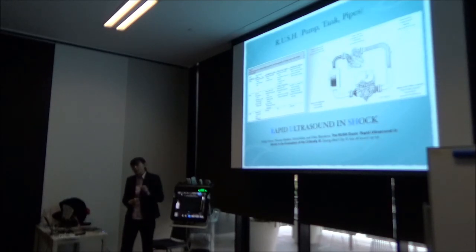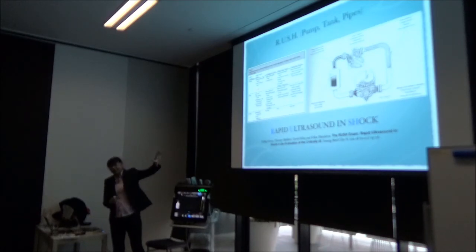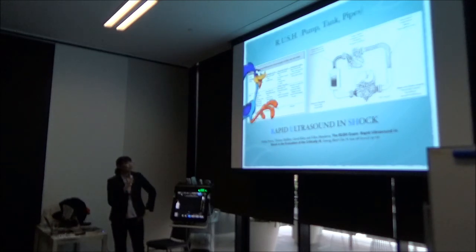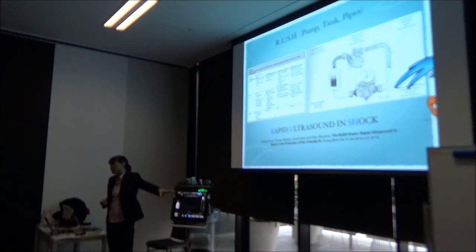But the reason why I like this one is, A, it breaks up the body into IKEA, and I like going to IKEA. And I also like not getting lost in IKEA. So it provides a nice roadmap there. And it also tells you when to do it, because you should rush to do it. So now if we get hypotension alerts or code activations from the field, our techs actually know to put the ultrasound in the room already, so I don't have to go hunting for it.